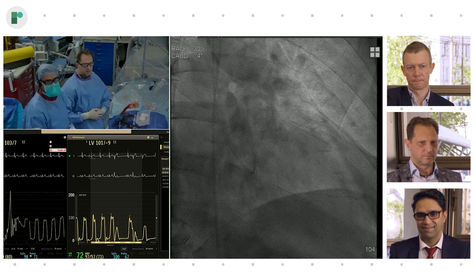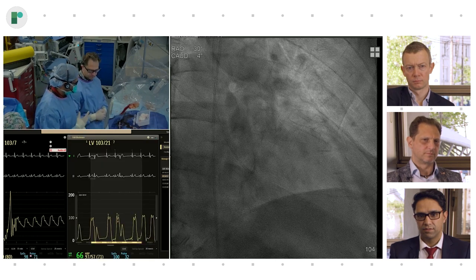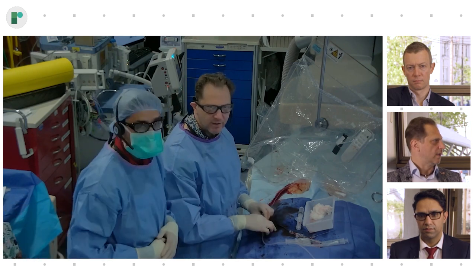Thanks for joining us. I think that was an illustrative case of imaging and physiology guided, zero contrast PCI, with some troubleshooting and a complication. Any final words of wisdom here, guys? No, I think great case. This is how we can do contemporary PCI in patients with renal insufficiency using current imaging and physiology techniques, specifically the Navvus microcatheter, which is a great technology for multiple assessments, both in a pre as well as in a post PCI setting.